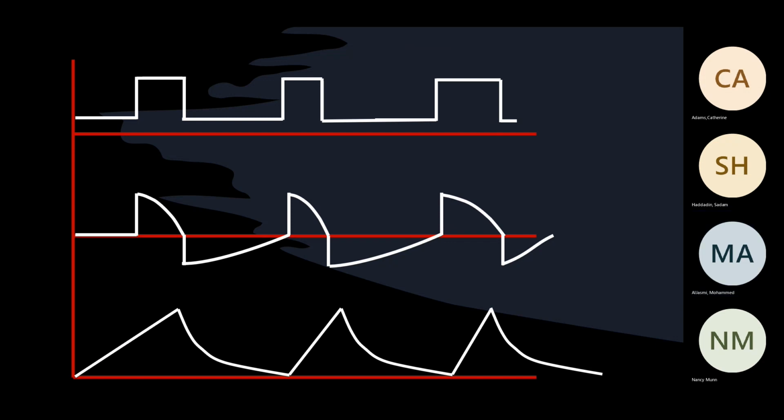But wait, if it's VC, IMV, the volume could change, is that right? The volume from the patient breath to the mandatory breath can change. I don't want you to stick to the basics of, you know, volume the same means it's volume control, volume change means pressure control. No, look at the whole concept of the flow and the volume. Got it? Guys, if it's not clear, let me know. Clear? All right.